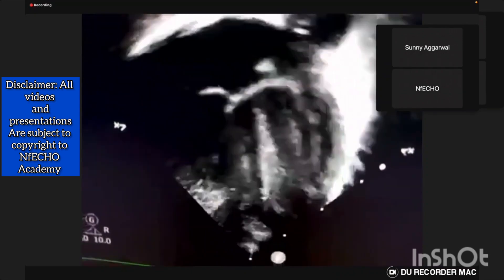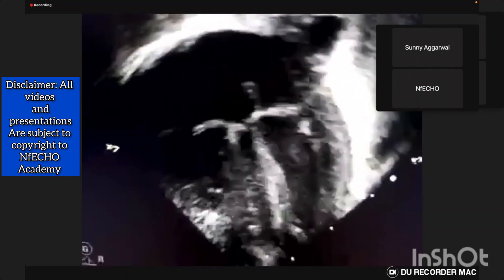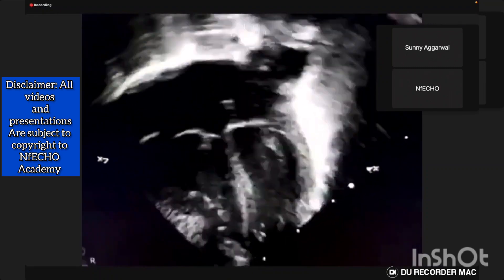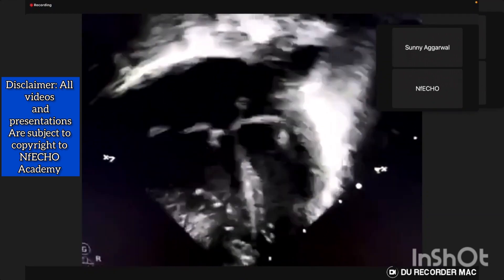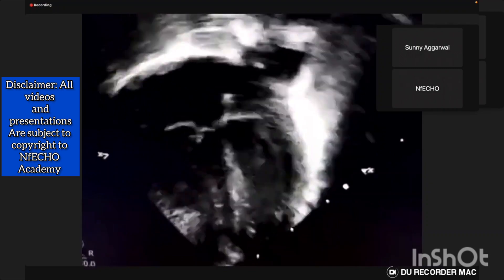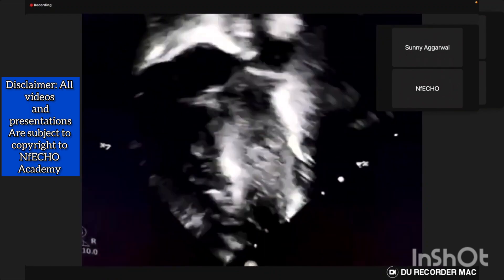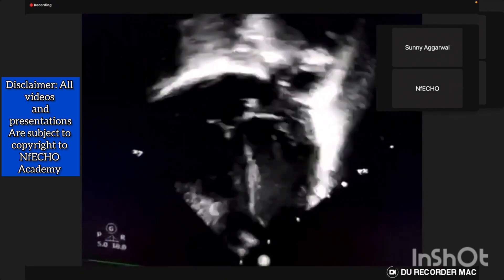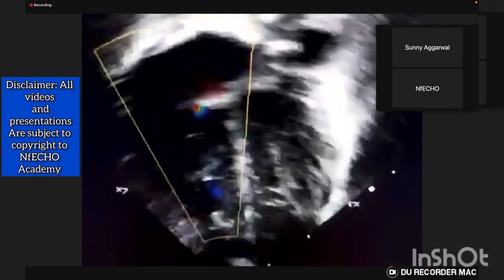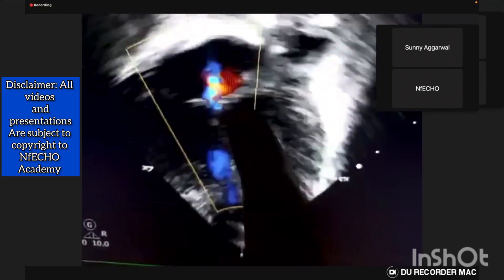When we apply a colour window, I check for flow from RA to RV. If any regurgitation jet is present, the tricuspid regurgitation jet will be visible. In this apical four-chamber view, the heart should be upright and straight so that all measured velocities are aligned with the direction of the ultrasonic waves — that is very important. With the colour window on, the red jet represents blood flow from RA to RV, and the blue colour jet is the tricuspid regurgitation jet — blood flowing from RV towards RA.